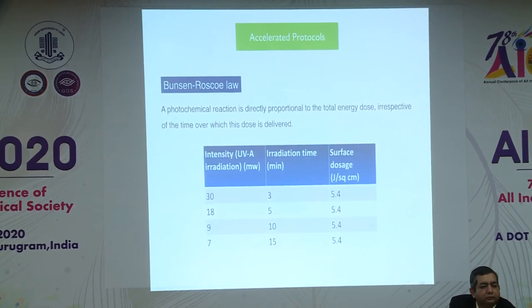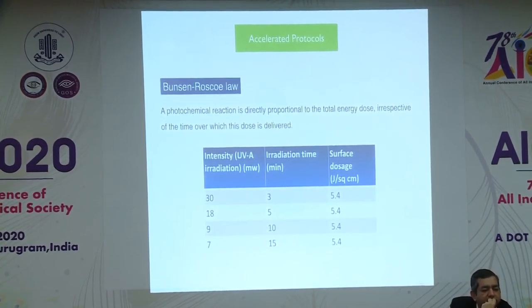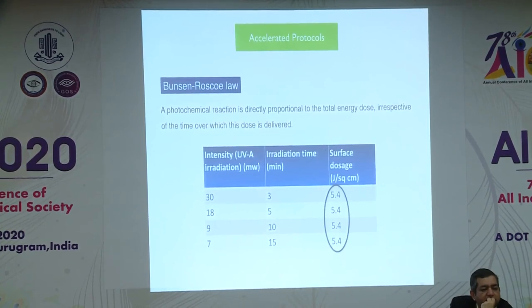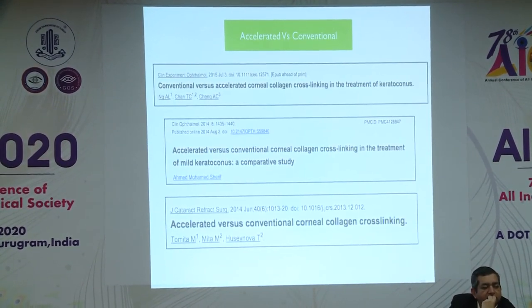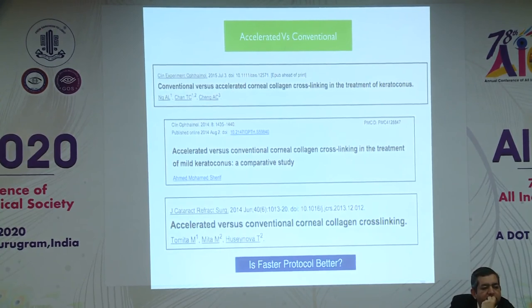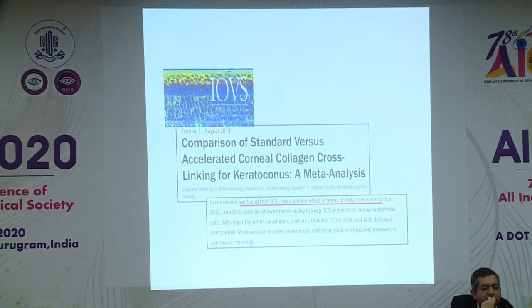So coming to accelerated protocols, it is based on Bunsen-Roscoe law, which states that a photochemical reaction is proportional to the total energy dose, irrespective of the time. So which means that if we increase the intensity, we can reduce the irradiation time and still the surface dosage will be same. There are enough number of studies which have compared accelerated versus conventional protocols. And then the question comes, is faster protocol the better? So it has been shown that standard cross-linking, that is the Dresden protocol, has greater effect in terms of the reduction in the maximum keratometry values, but in terms of functional vision, accelerated and standardized protocols are almost the same.